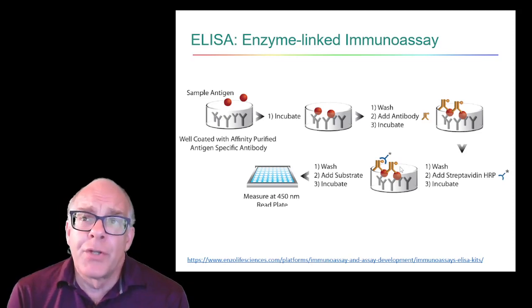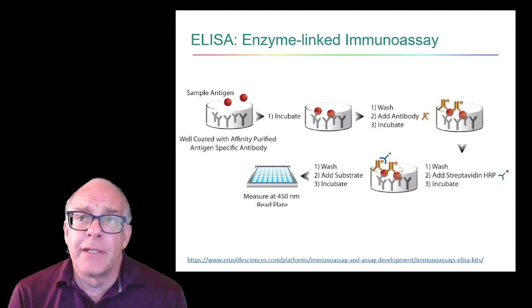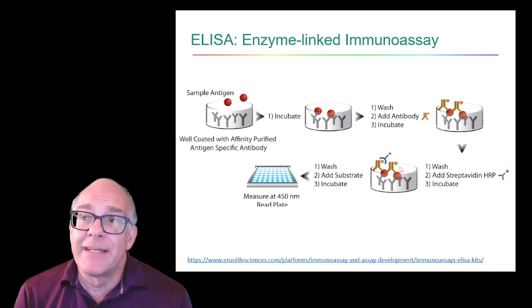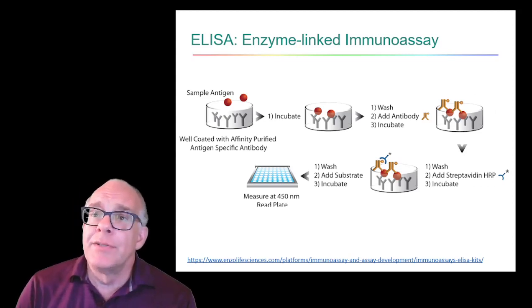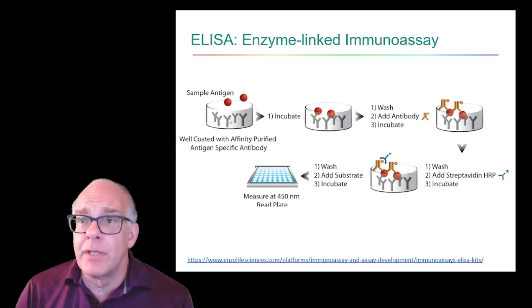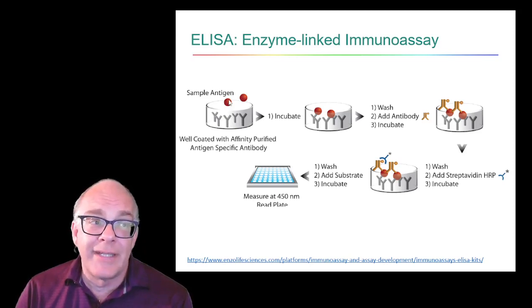And the way that we're going to measure cortisol within the laboratory this week is to do an enzyme-linked immunoassay, an ELISA. And so the concept with an enzyme-linked immunoassay is that we're going to use antibodies. Antibodies over here are these little Y-shaped proteins. And as we're going to talk about when we get to the immune system, these antibodies are going to be very specific at binding to their target. In this case, the antibodies are going to be very specific at binding to the little red dots, and the little red dots are going to represent cortisol molecules.